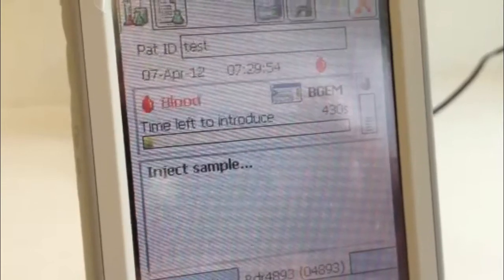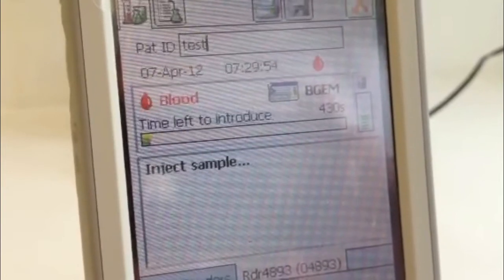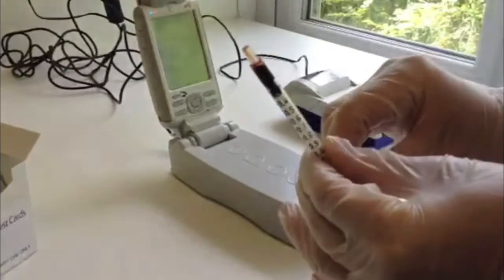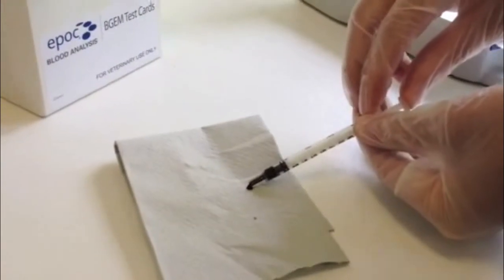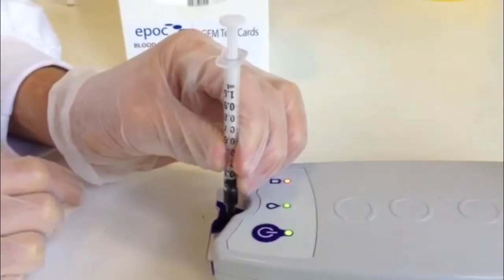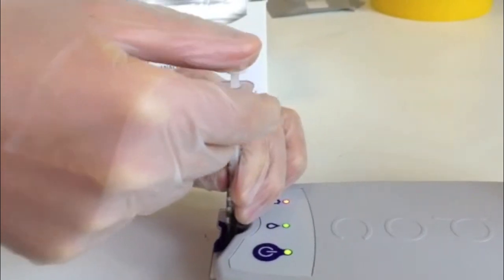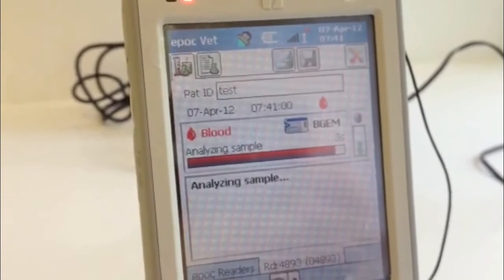Once the calibration cycle is complete, the analyser will display 'inject sample' and you have 7 minutes to introduce the blood into the EPOC test card. Ensure that there are no bubbles in the sample, it is not clotted, and that it is sufficient. Expel the first few drops into a tissue. Connect the syringe with the sample well and rotate a quarter turn to ensure a good connection. Press the plunger down in a smooth, steady motion until the analyser beeps to inform you that the required sample volume has been injected and that it has started to analyse the sample.